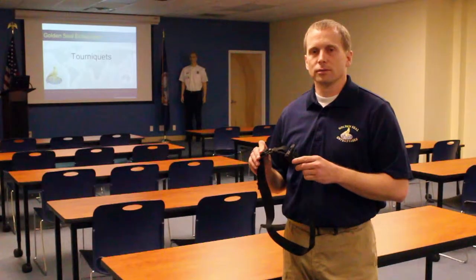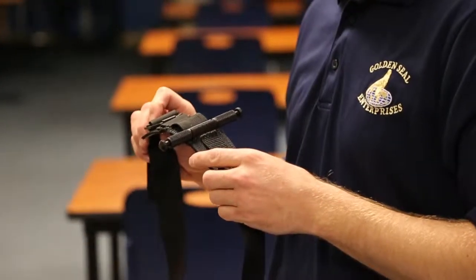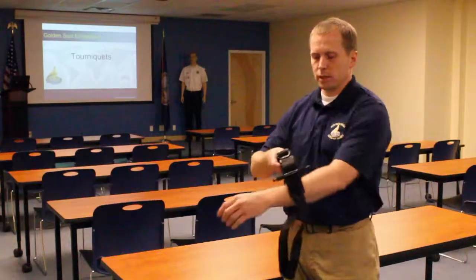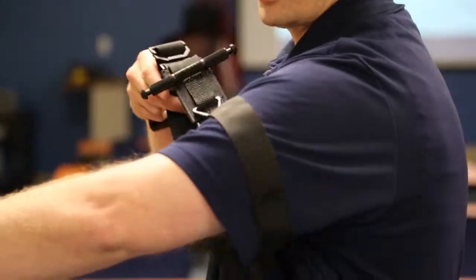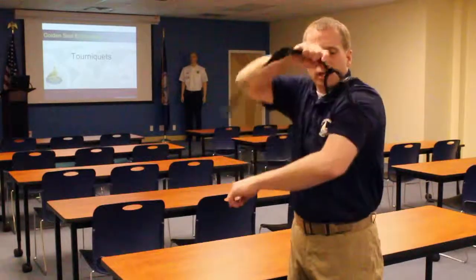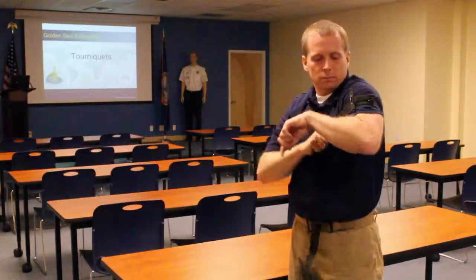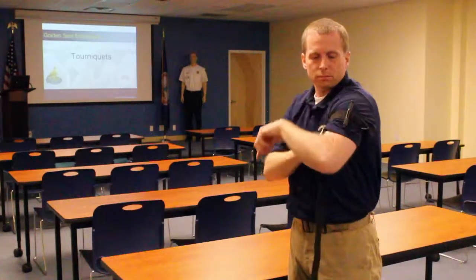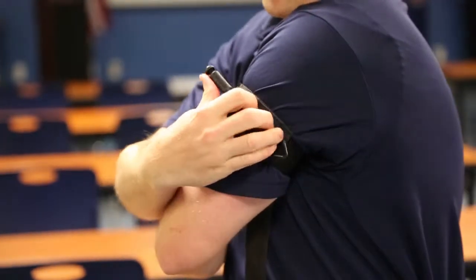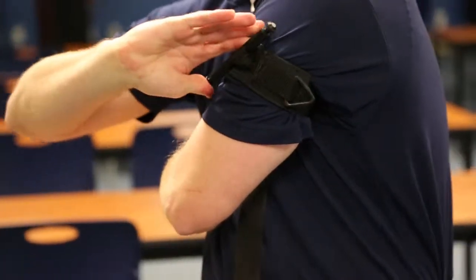Tourniquets recommended for use in TCCC, or tactical combat casualty care, are designed to be applied by yourself using self-aid. You simply grab the running end of the constricting band, place it on the arm or leg that you'll be applying the tourniquet to, cinching the tourniquet down until it's as tight as you can get it. Then take the windlass — this metal rod — whose purpose is to provide the tension and compression on the artery until bleeding is stopped.